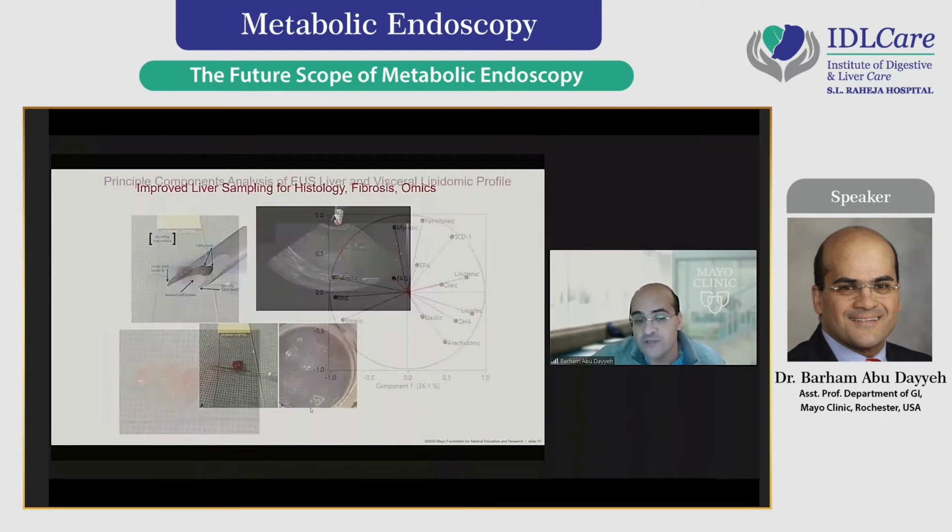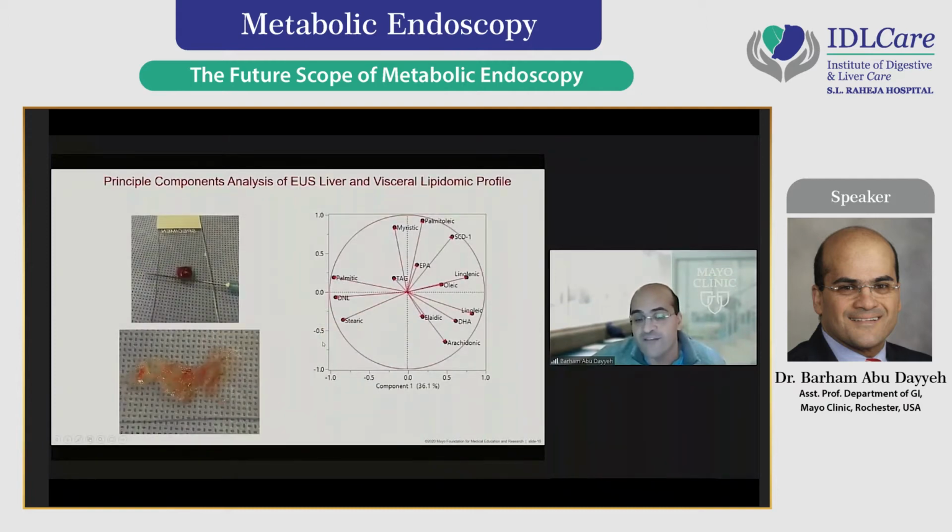And now using this method, we could classify the lipidomic profile of inflamed, unhealthy fat, both in the liver and from this metabolic triangle from the celiac axis as shown here, indicating that we could use endoscopic ultrasound to do prognosis for metabolically healthy versus unhealthy obesity in a way that no other technology could do.